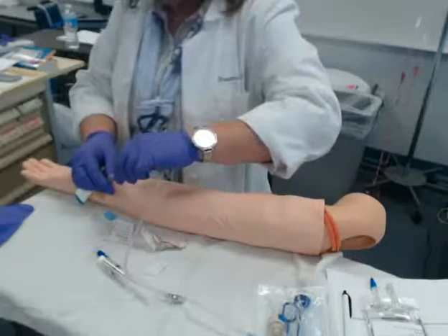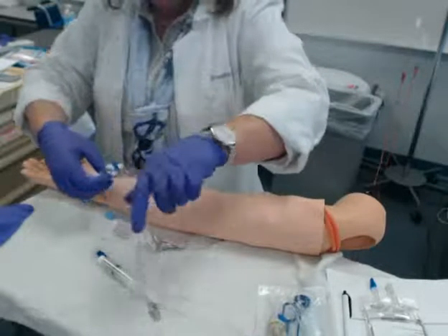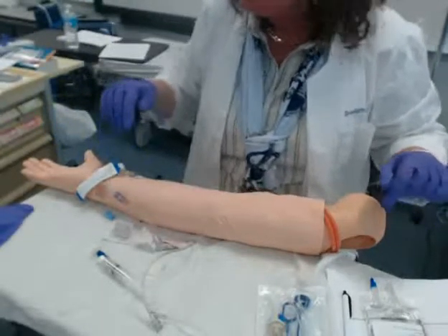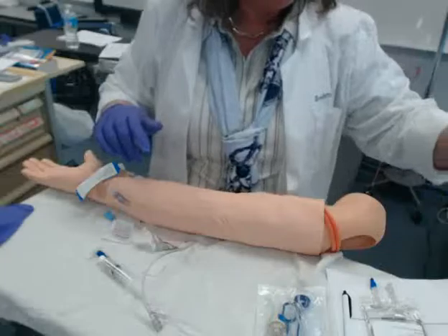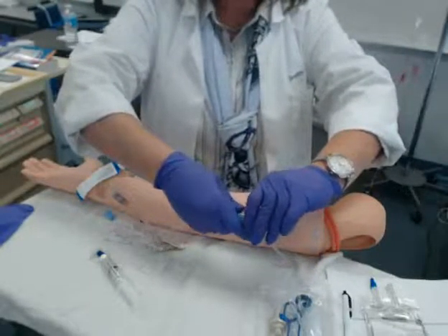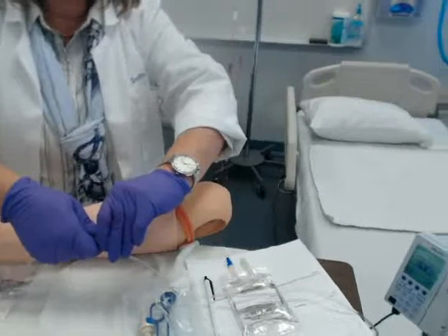I'm going to cap my saline, and then I'm going to connect my IV fluid. Take the cap off. I need to clean my port again, because every time we access our port we have to clean it. Cleaning the threads, wiping off the top — up to 10, which is 15 seconds. Let it dry for 5. I'm going to connect this again — push it in, that valve, and tighten that lock on there.